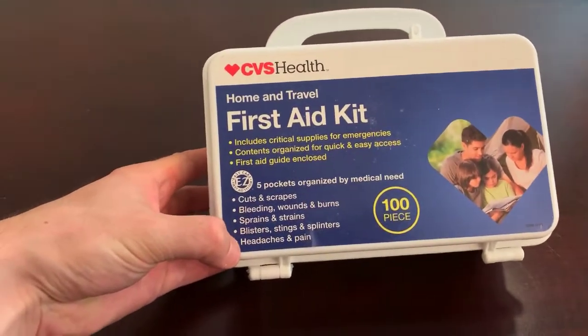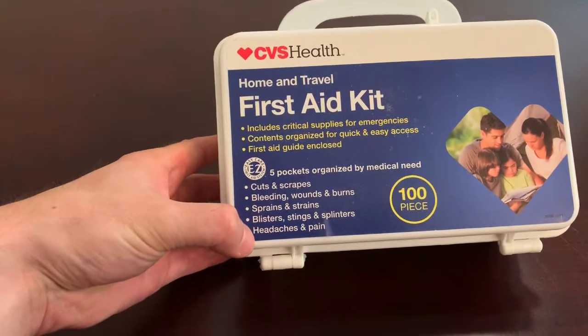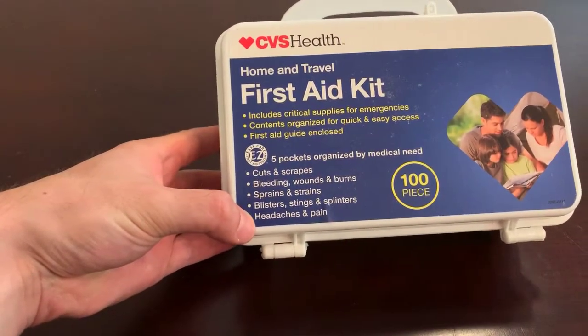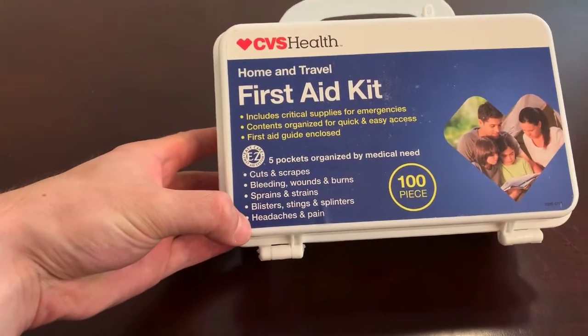It's good for cuts and scrapes, bleeding wounds and burns, sprains and strains, blisters, stings and splinters, headaches and pain.